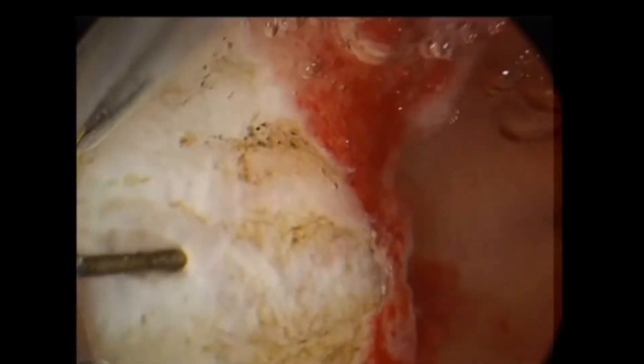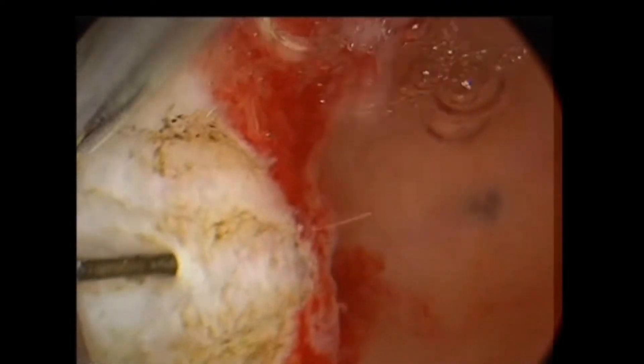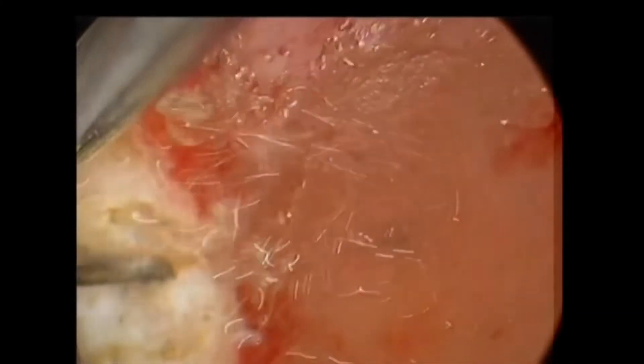Now I'm going to give you a pause to enjoy septum release. I don't call it septum incision or excision — I call it septum release, because I have a theory about the embryology of the septum, the histopathology, and the nature of the septum.